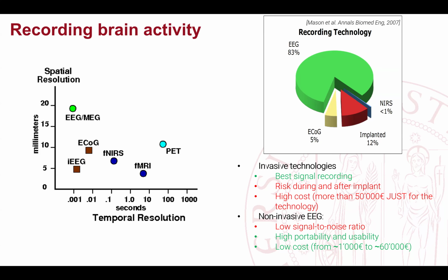But again, it's not mind reading. They are asking the user to think about producing the mouth movement that would generate that sentence. This is a motor activity. Motor activity can be recorded from specific areas in the brain. So what they are decoding is actually the imagination of the movement of the mouth, which is related to the generation of sounds, and the combination of sounds is the generation of words. A combination of words can be given to, I don't know, a large language model to understand the sentence. So that's normally how they work. So it's not really mind reading. They are decoding the mouth activity mostly.